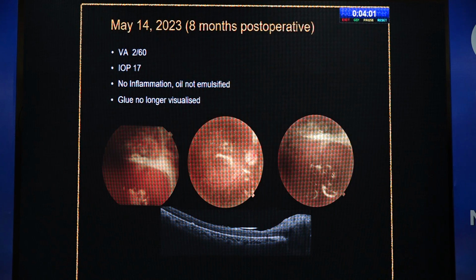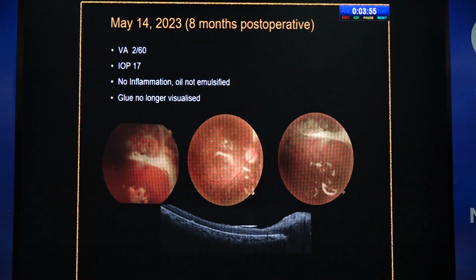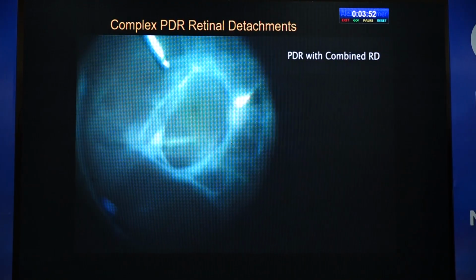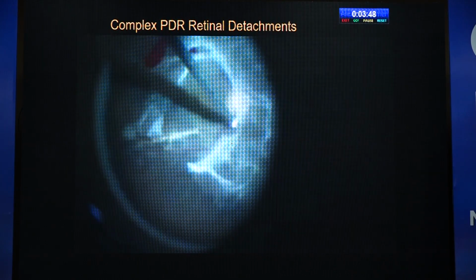Encouraged by this, even on long-term follow-up, she's doing well. The retina is attached, there is no inflammation, intraocular pressure is normal, and the glue is not visualized within a few days after surgery. So encouraged by this, in complex PDR we started using it where we could not do laser to close the breaks.